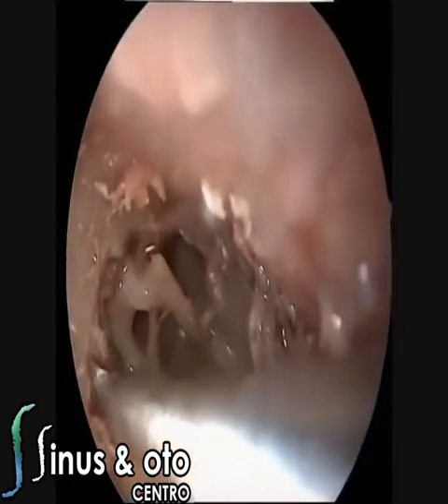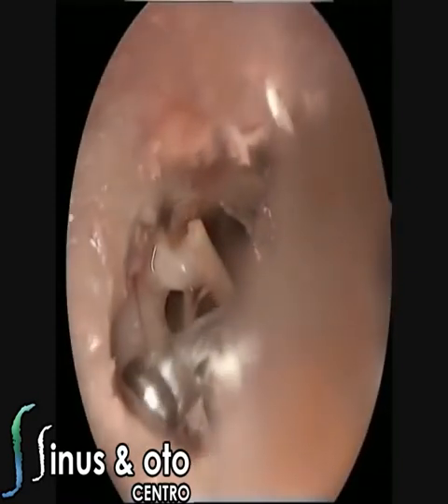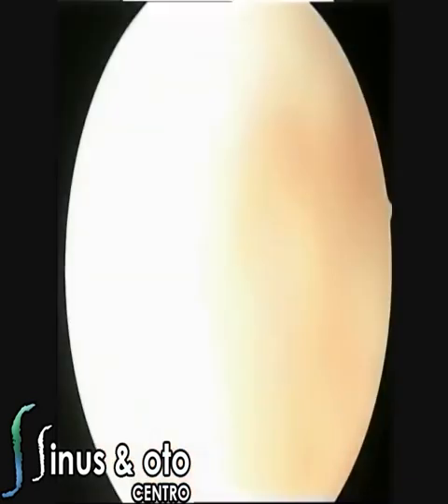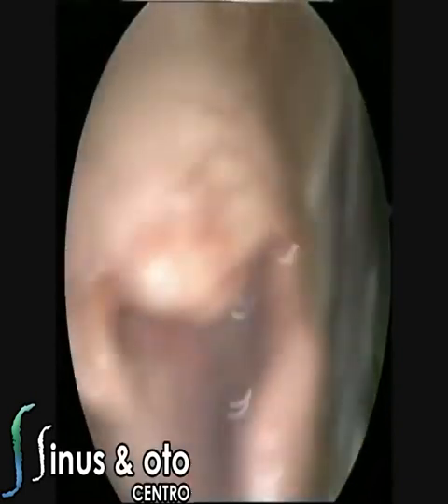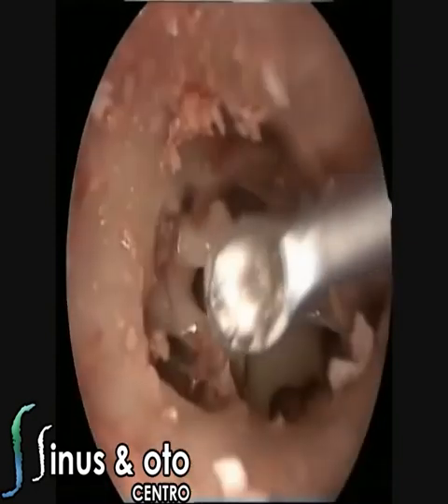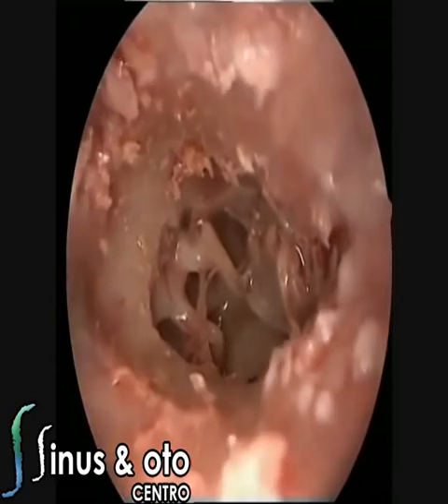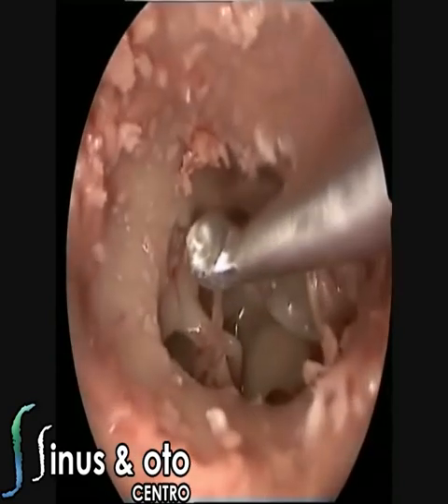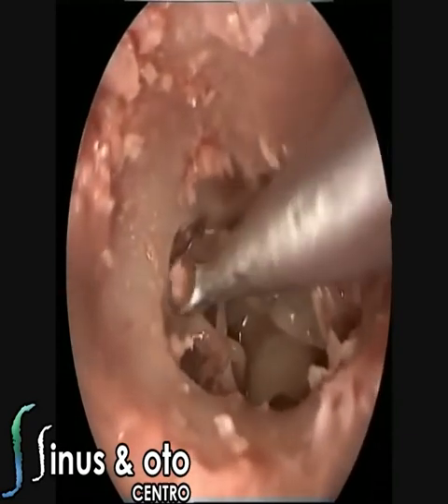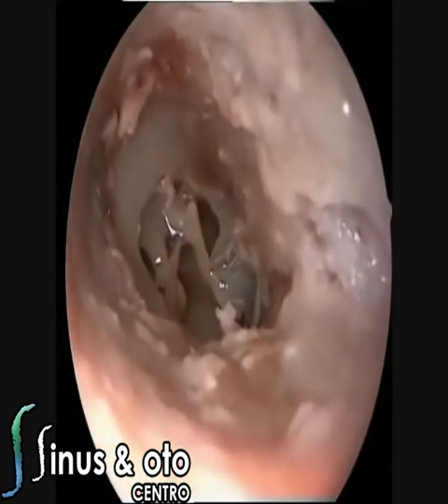Of course, we are using a curette to remove a little bit of bone of the scutum, and as you can see there's not much bone that is removed, and that improves our view a lot. So even with the 0-degree endoscope and even removing less bone and using only the curette, you see the space that we gain. Of course we have the chorda tympani nerve over there, the long process of the incus, the articulation between the malleus and the incus, and sometimes we can see the short process of the incus, and you can understand the ventilation pathways.